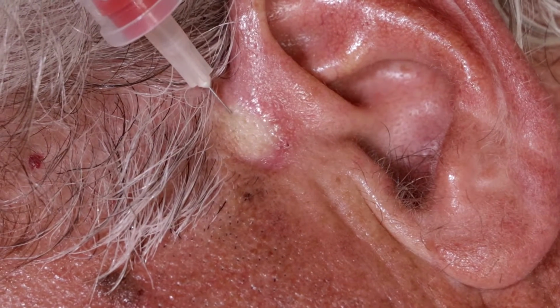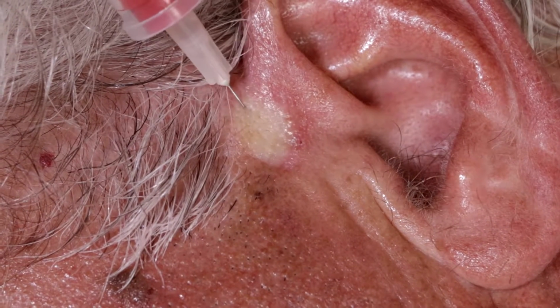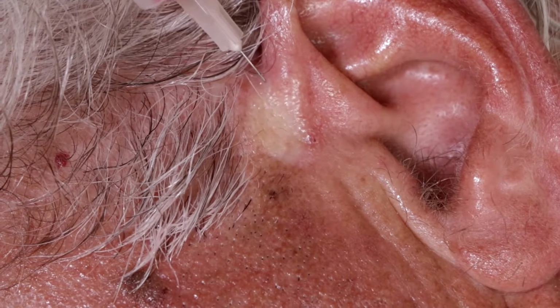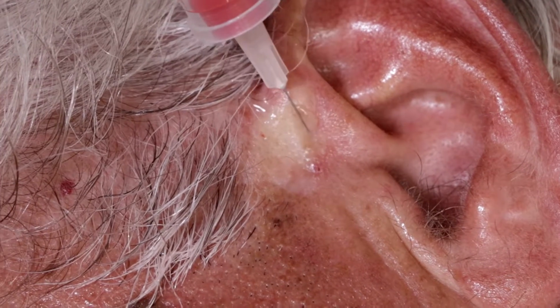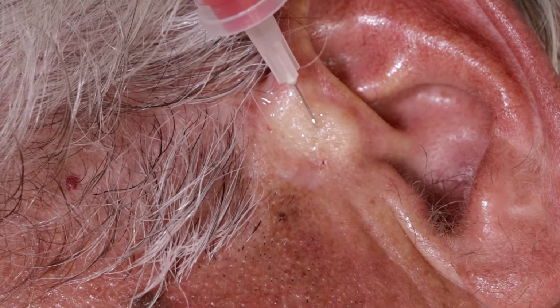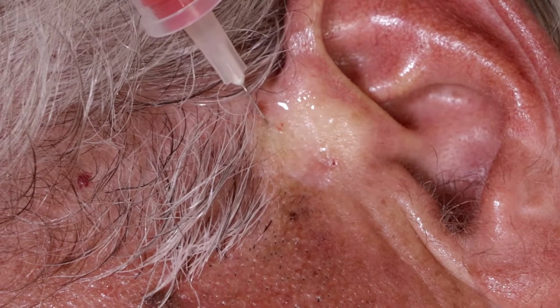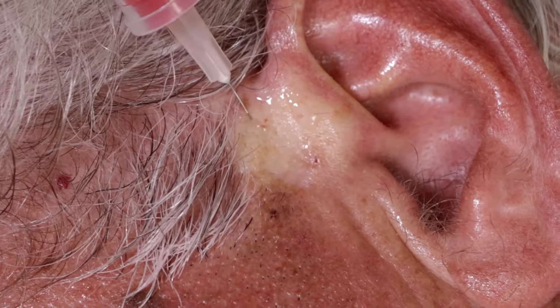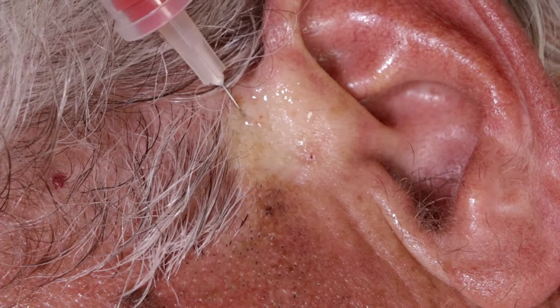So I'm putting in some anesthetic, lidocaine 1%, with a little bit of buffer. I'm going to numb up quite a broad area here. I don't want to go too much in the ear because I am using epinephrine. But we do want to get all the area that the curette takes off. So we'll do a rather large area. And the way this curette works is only the stuff that's supposed to come off does.